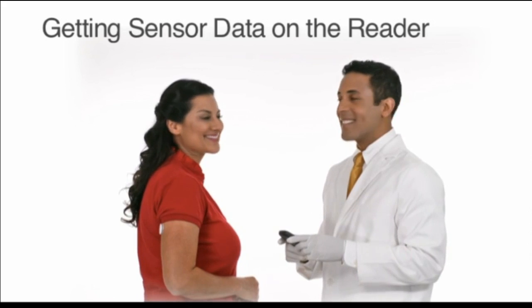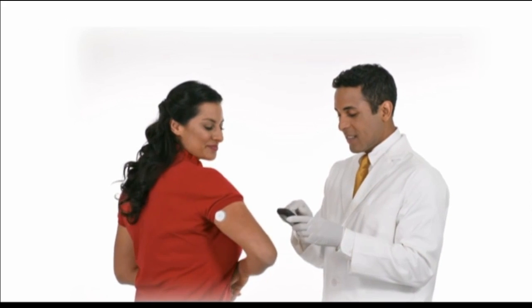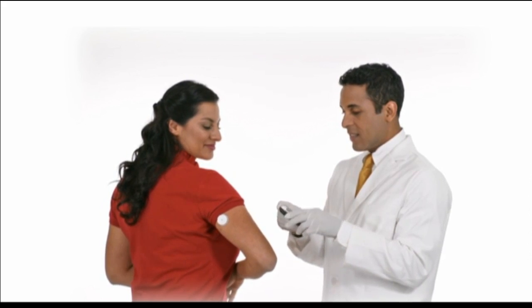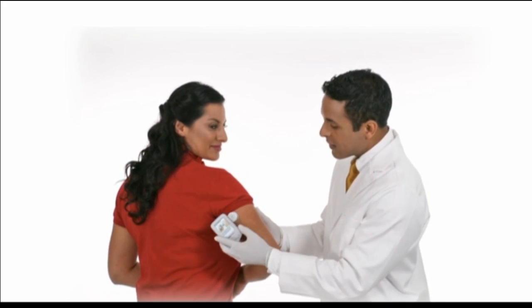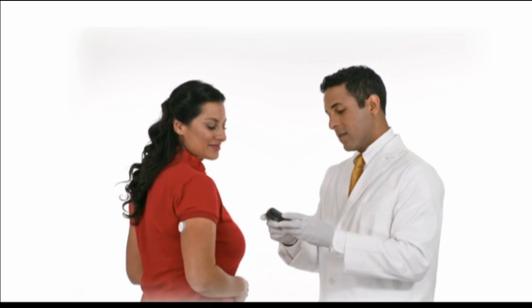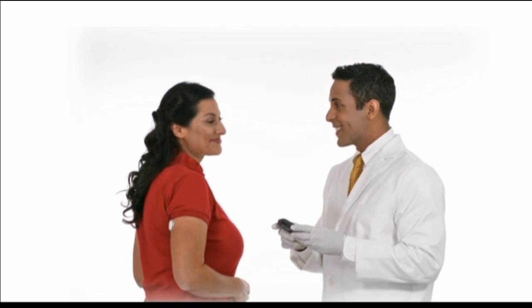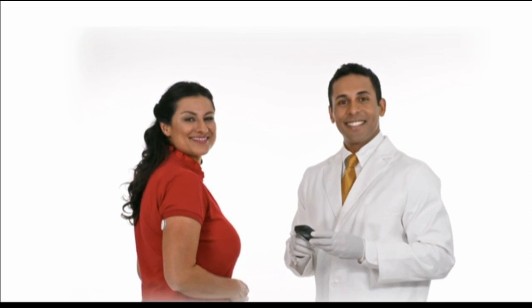Getting sensor data on the reader: press the home button to turn on the reader, then touch 'Get Sensor Data.' Hold the reader within 4 centimeters of the sensor. If sounds are turned on, the reader will beep when all the data has been successfully downloaded from the sensor.